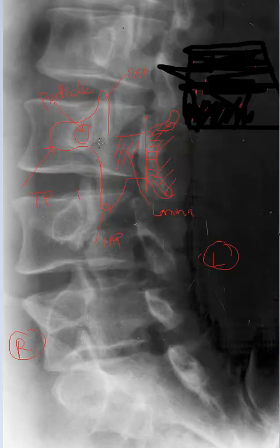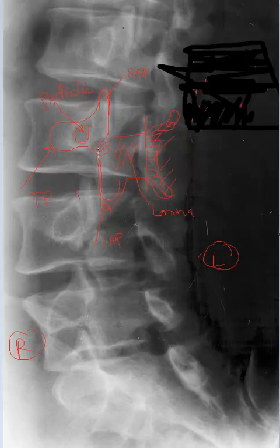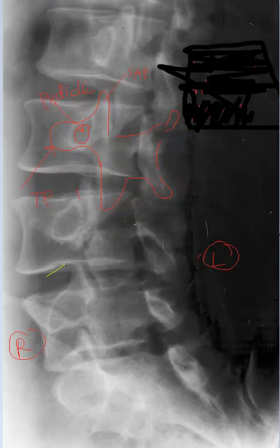The pars inter articularis region lies between the superior articular process and the inferior articular process — this area corresponds to the neck of Scotty. You should not have any conspicuous lucencies in this area. If you do, as indicated in the example below, notice that Scotty's neck is broken at that level. We conclude that this patient has a pars inter articularis defect. This level is L4.